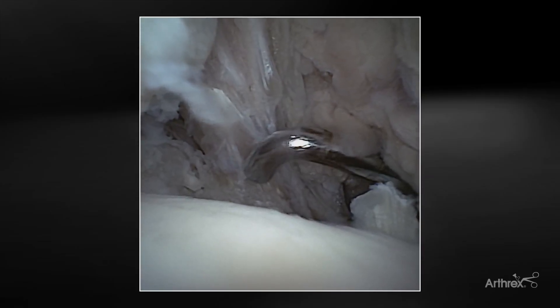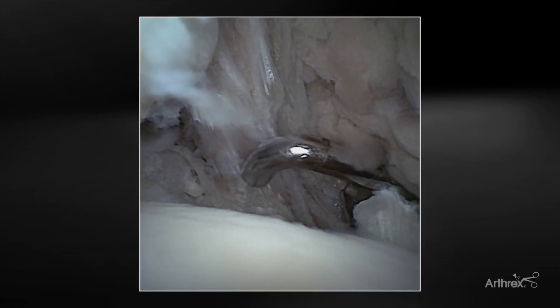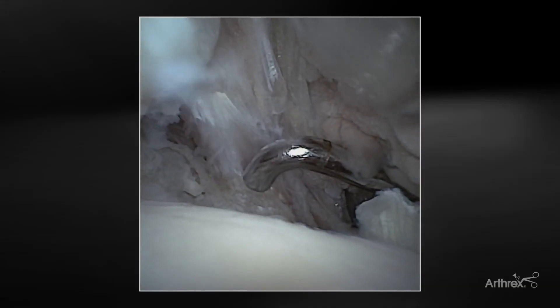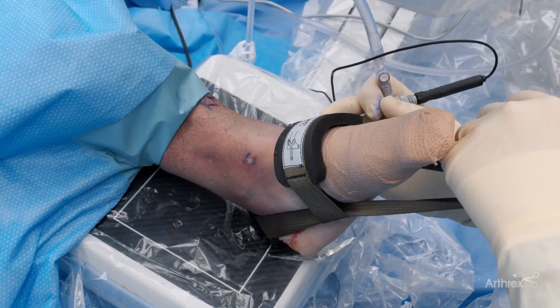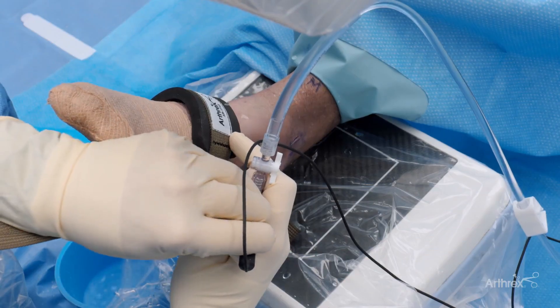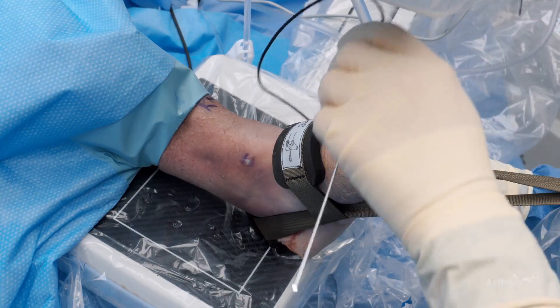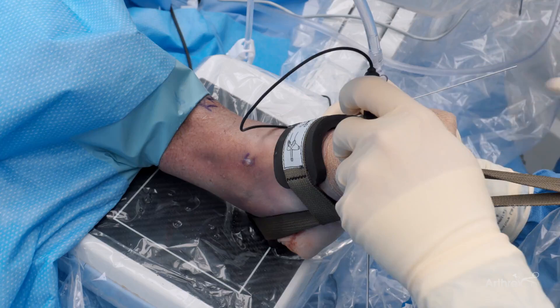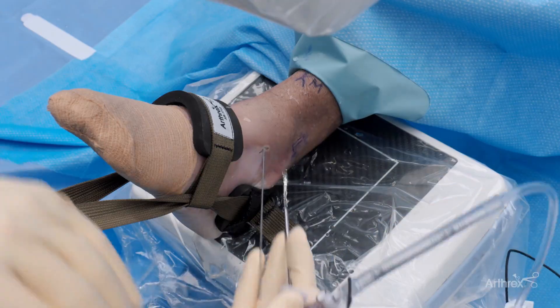After the tightrope is placed, we repeat a dynamic stress examination. For higher demand athletes, we add a second point of fixation because these athletes require it. Looking at the syndesmosis and the AITFL insertion on the fibula and distal tibia, we will reconstruct the AITFL using internal brace. We directly visualize the insertion of the AITFL on the distal tibia, take nano, pull back, visualize the footprint, and drive right into the footprint to secure it to the distal tibia. We confirm under fluoroscopy, holding the same angle. The guide wire from the IB kit goes straight down the sheath and is advanced under power — all arthroscopic. This protects the superficial peroneal nerve completely during the whole procedure.